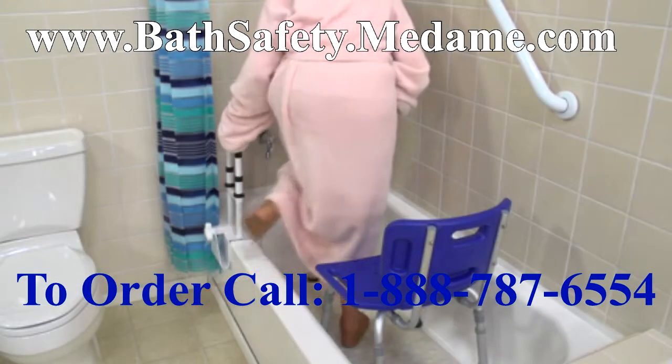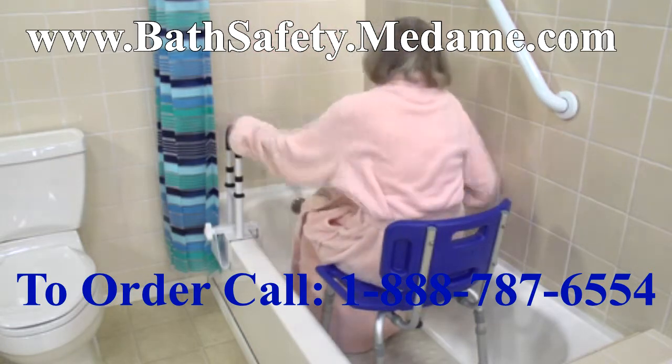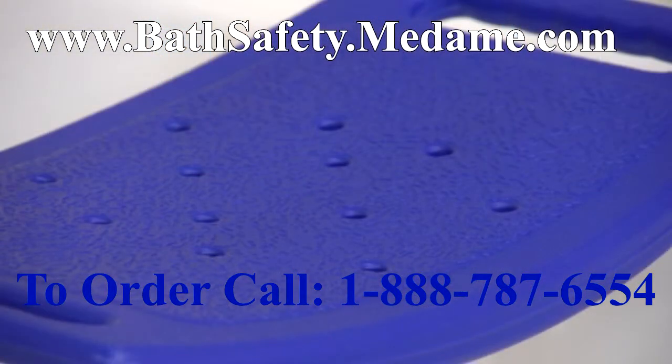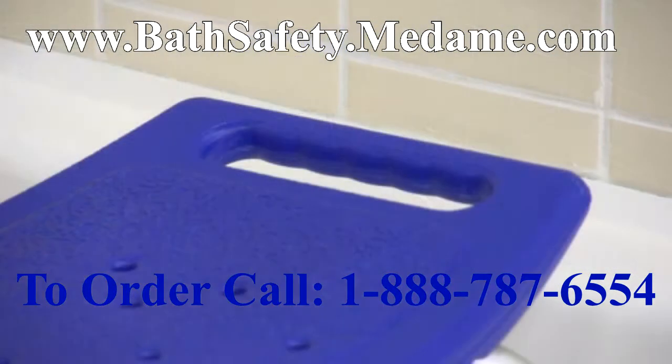This lightweight aluminum frame is corrosion proof and strong enough to support up to 400 pounds, and drainage holes reduce slippage. The contoured seat provides maximum comfort, has handles for added security, and is easy to clean.